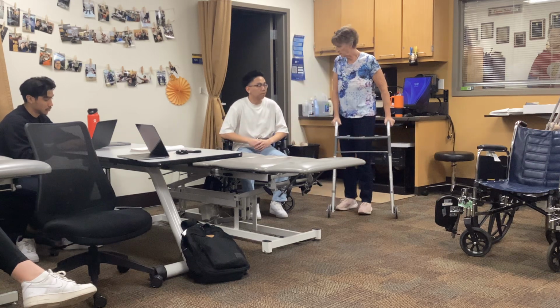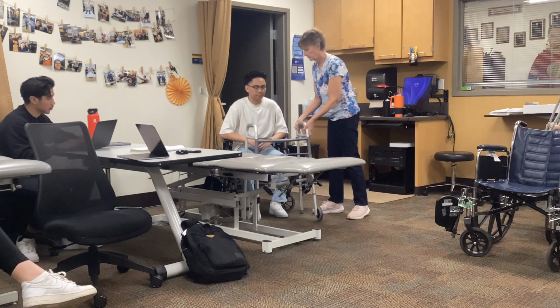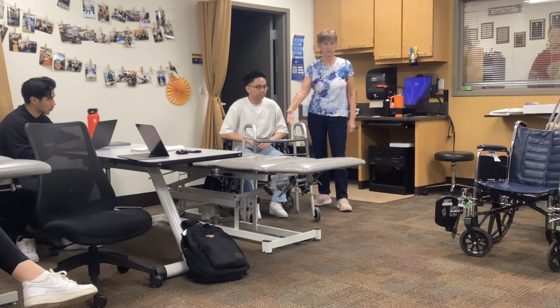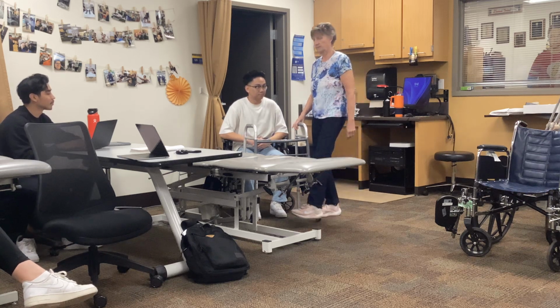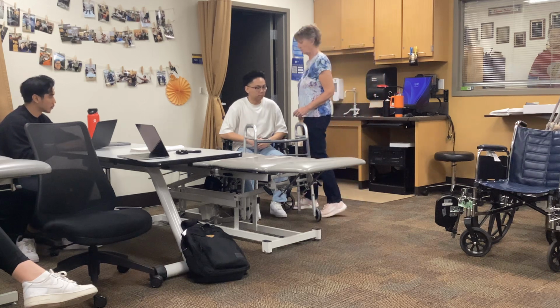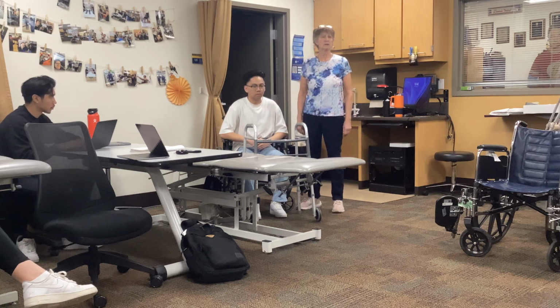How tall are you? 5'9". Oh, that's good. Now obviously I cannot be in front of the patient to have my leg guarding his leg in contact with it, correct? Because we're not going to try to come through or come under; that would all be unsafe for both of us. So if I am transferring him this way, which is his stronger leg, which is his involved or weaker leg?